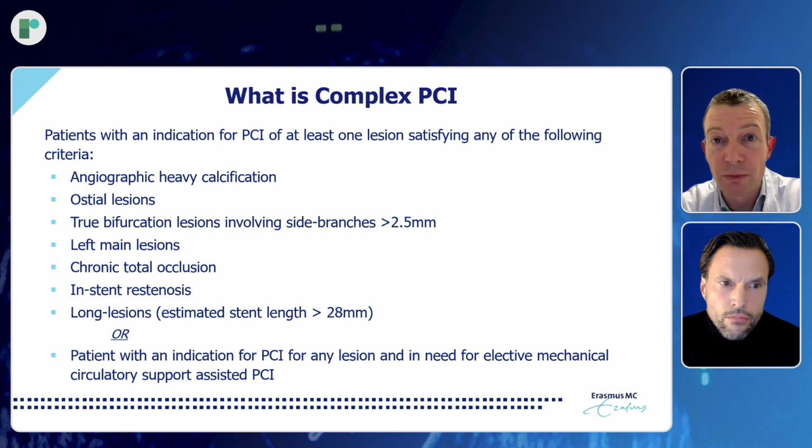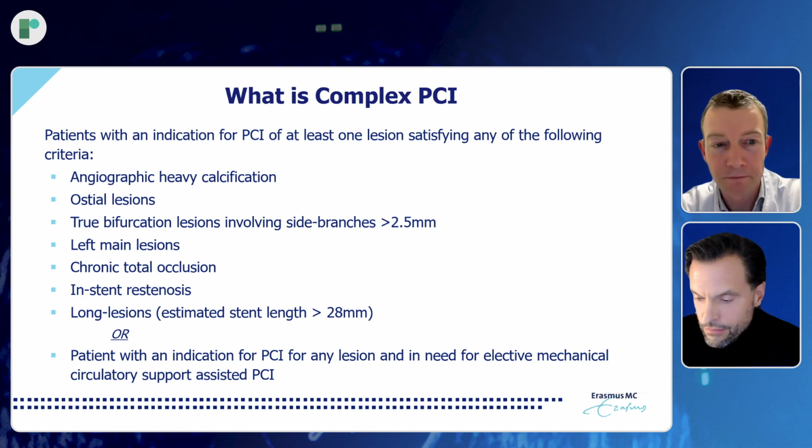Not limited to calcium, of course. Complex PCI also involves osteal lesions, true bifurcation lesions, left mains, and CTOs, as mentioned. In the past, you went to CTO Congress. There's a lot of tools and techniques, but virtually never you saw intravascular imaging. Whereas as of today, I don't think there are many CTOs performed across the globe without the use of IVUS. So that's really a specific interest for the use of imaging.